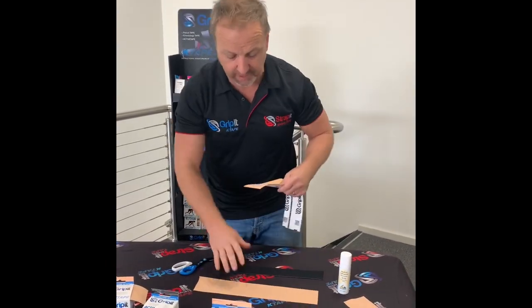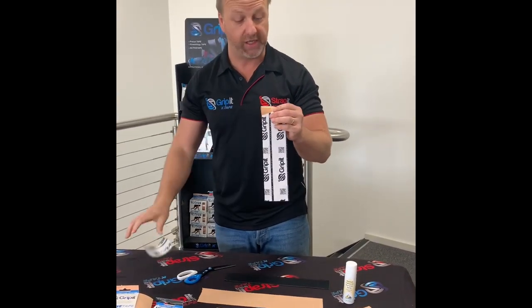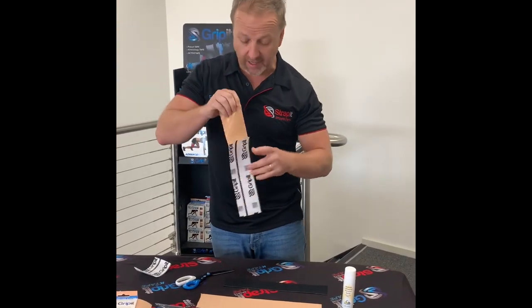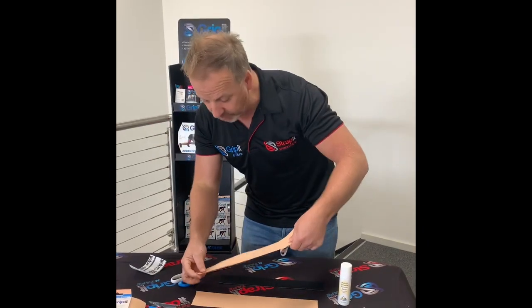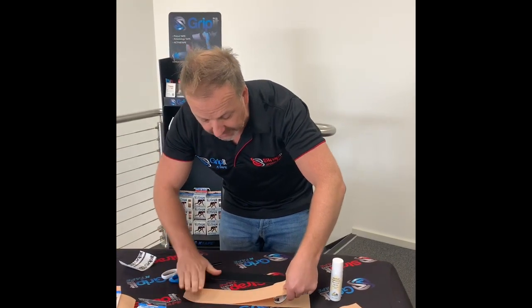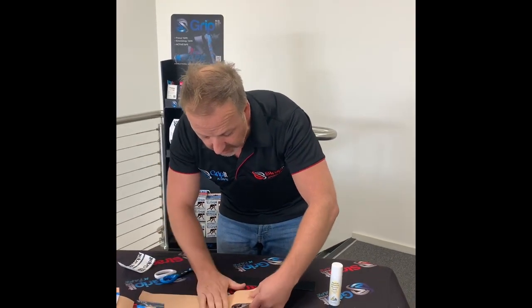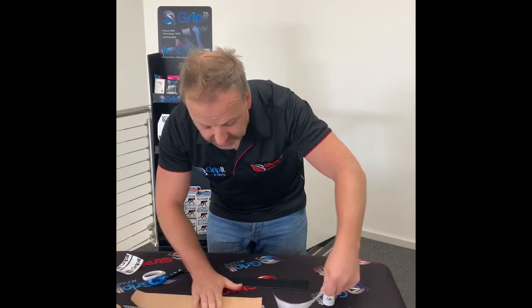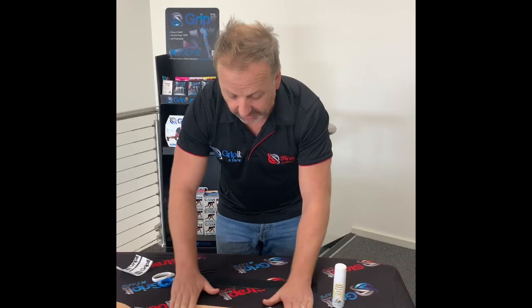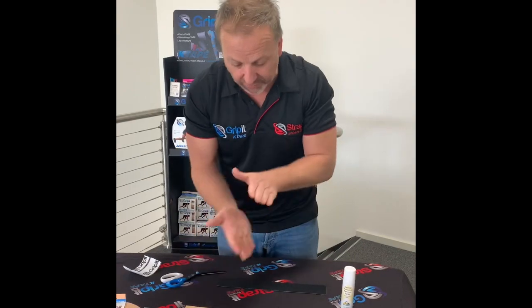Here we've got 7.5 centimeters. The first thing is that you have the option with your taping, if you want to have more energy and more strength in the tape, to have a couple of layers, or you could have 3 layers. It's all based on experience and also in terms of what amount of storage of energy you want to put into the tape, so energy and or what you want recoiled. You can see here, I applied 2 layers. It's easiest to do that and laminate that before it goes on the patient. Because the glue is acrylic and heat activated, we do need to warm that up and make sure these layers are nice and bound to each other.